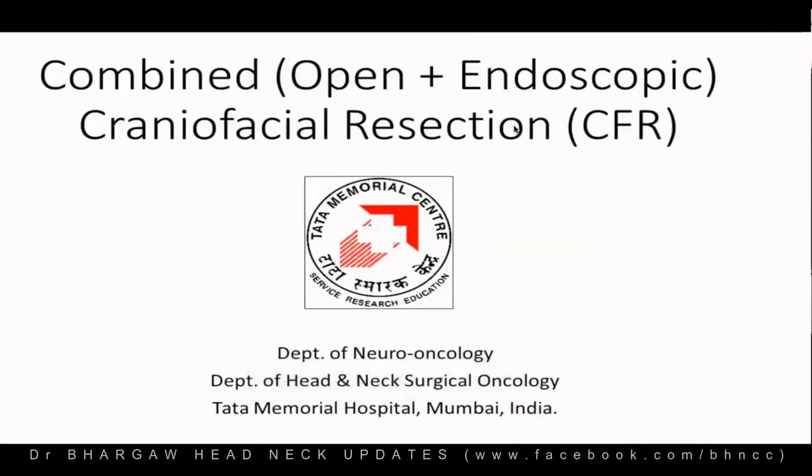It's not about the depth. If there is intracranial extension, as you clear the tumor, there's a space that is developed. So the depth is not the first question here. The first question is the lateral extension, as we have already seen. When it goes lateral to the medial orbital wall, that is when you don't want to do an endoscopic resection and reconstruction.